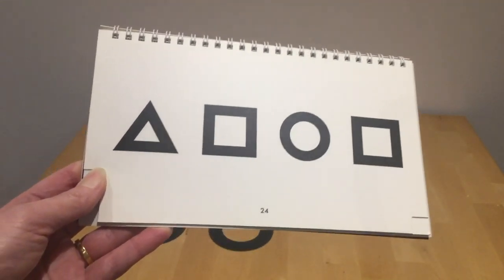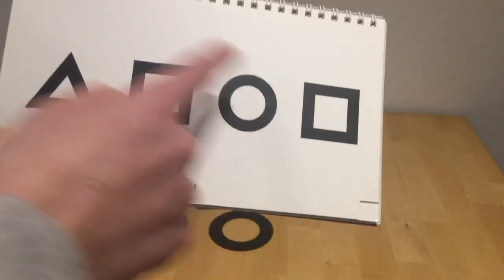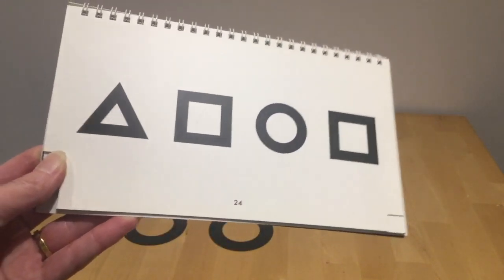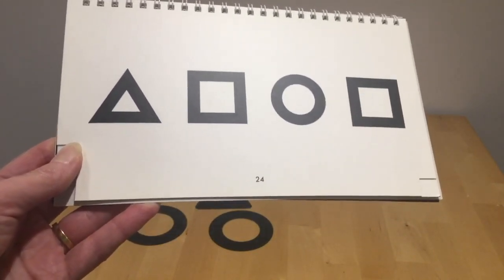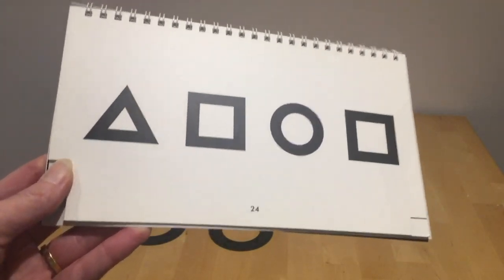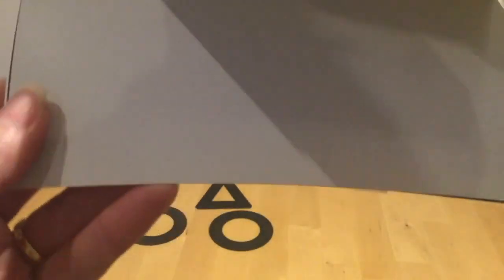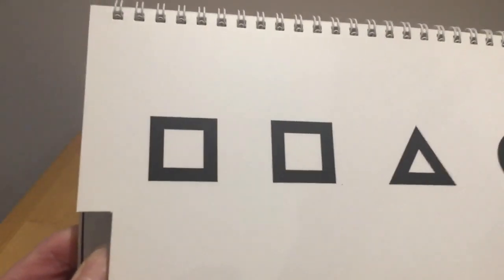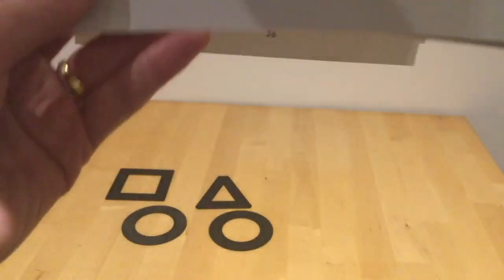If you do something like that, always choose one of the symbols that's in the middle. Because of crowding, it's much easier to see the ones at the end, and it's often the ones in the centre that the child or young person will get wrong. So just quickly move on. We have 18 here. There we go.